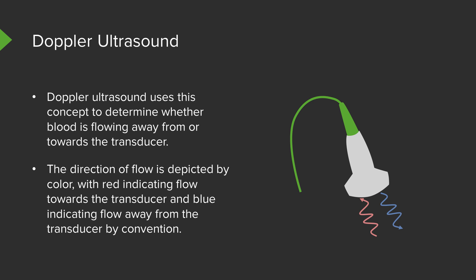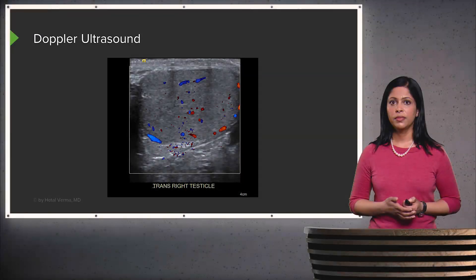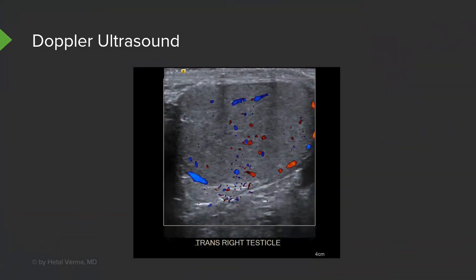This is done by convention. This is an example of Doppler ultrasound showing flow within the right testicle. You can see areas of blue and areas of red, demonstrating flow in both directions.